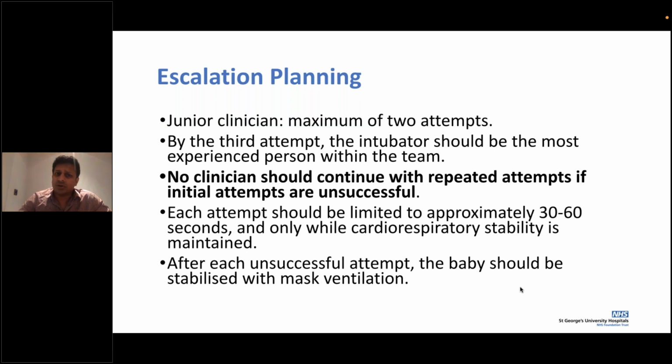So try and limit the number. There is almost always some kind of discussion as to how many attempts you are going to be given. In that case, it's very likely to be one or two attempts. But even if the first attempt is looking on direct vision at the structures that you're aiming for, that in itself is a good experience.